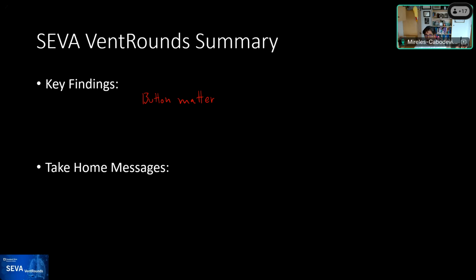And we stopped everything, and it's coming out. And so we want to maintain the minute ventilation, but we also want to minimize the interactions, the patient-ventilator interactions. And so we started with flow trigger. We were having some missed triggers, and we decided to use the intelligent algorithm to see how it would work for him. And so far, he seems to be synchronous. So buttons matter for all this sake.